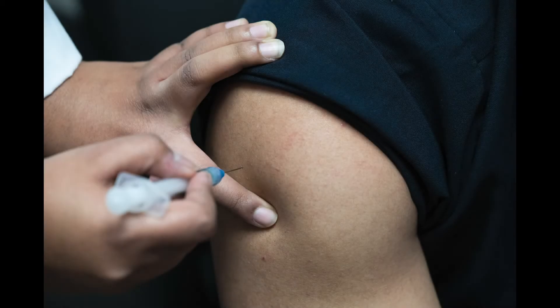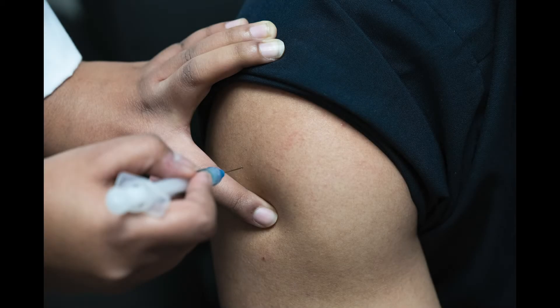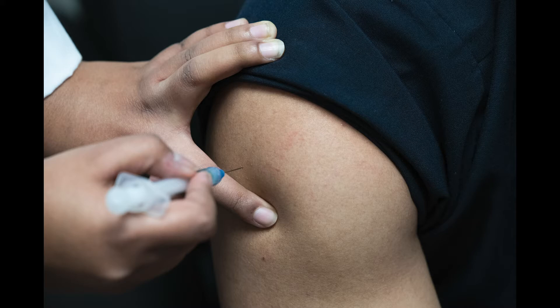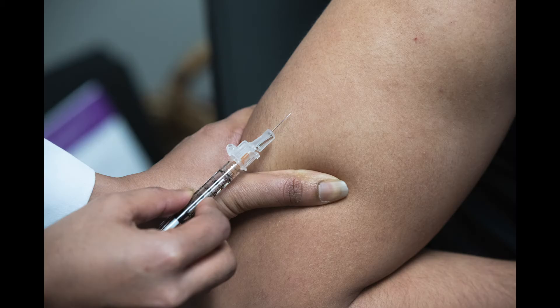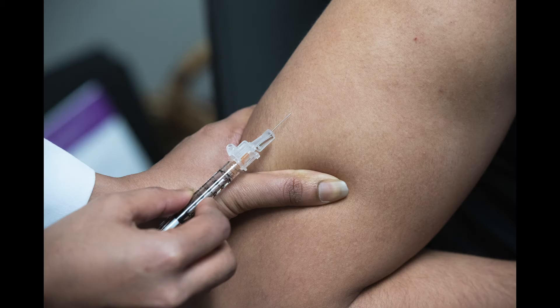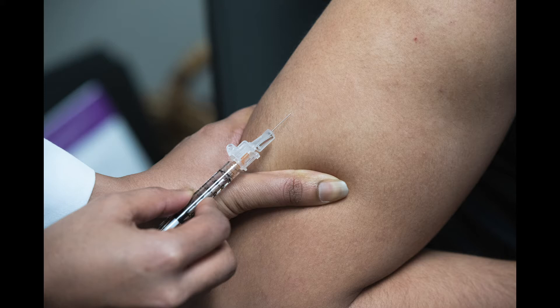Once that is determined, select and address the administration site. In adults, the preferred site for intramuscular vaccine administration is the deltoid muscle. For subcutaneous vaccines, use the area in the mid-third of the upper arm on the outer aspect.